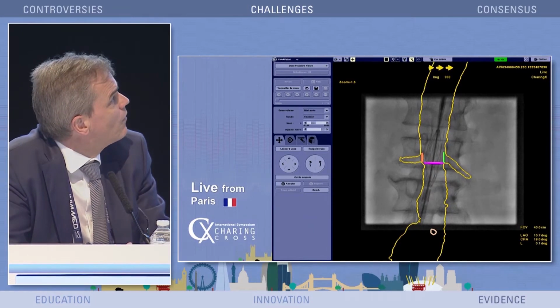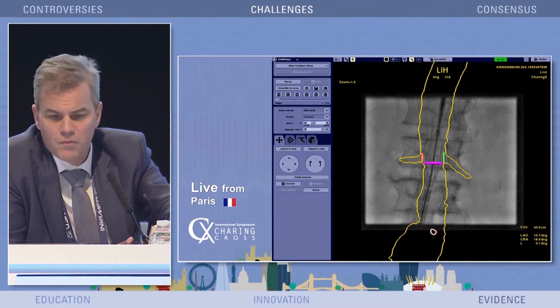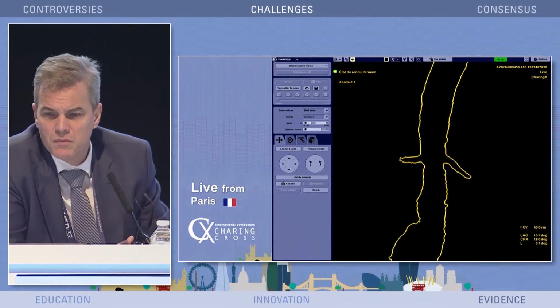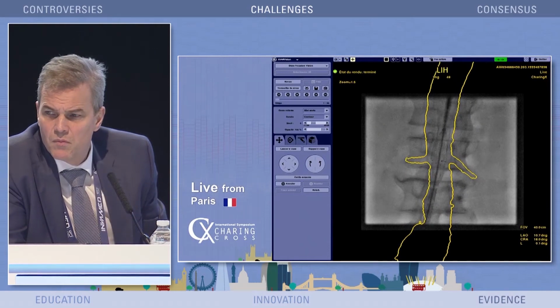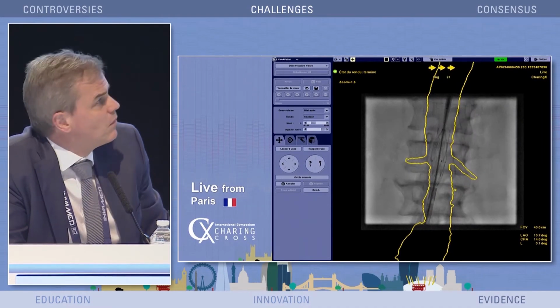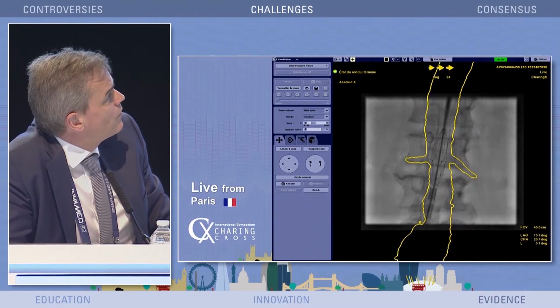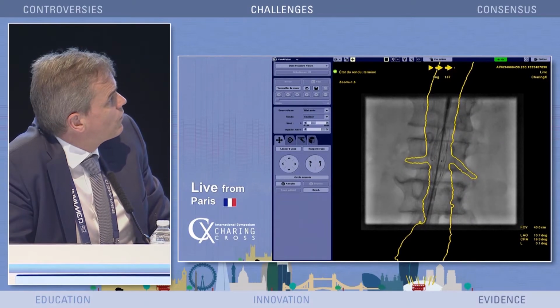opening. Now I want to check that I'm in a good working position. I'm checking that the 4 markers are actually lined up. So they're not perfectly lined up. I'm going to slightly change the angulation. So probably this is not too bad.